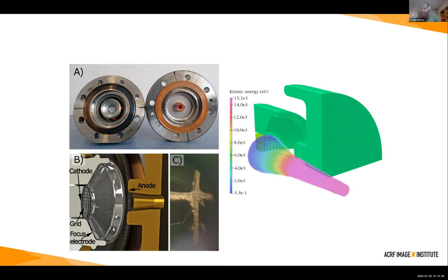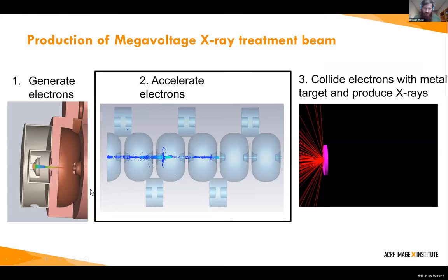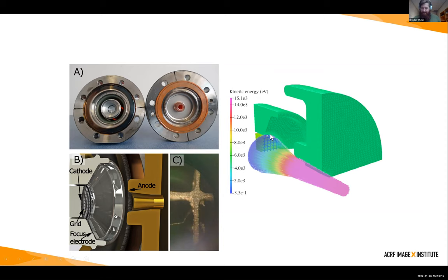I actually have the electron gun here — I'd normally pass these physical devices around but that won't be possible today. This is the actual electron gun; this is just the cathode end. This was a piece of research where we wanted to build a model of this gun — we took surface imaging of the entire thing, reconstructed the geometry, and used finite element modeling to model the beam. The key thing to take away is that all this is doing is generating a steady stream of electrons — essentially a DC electron beam being injected into the electron accelerator.